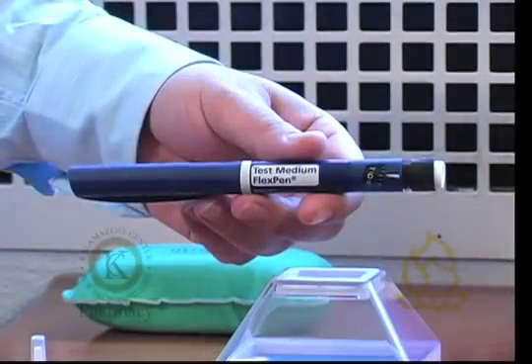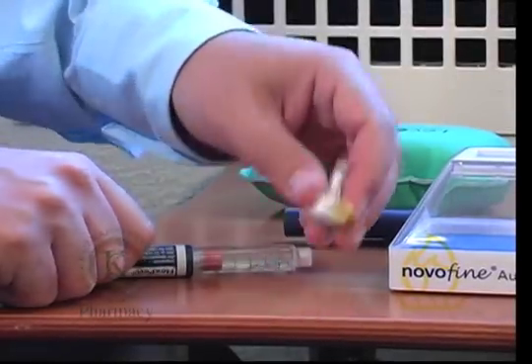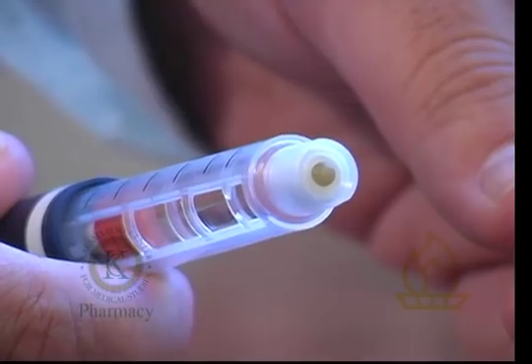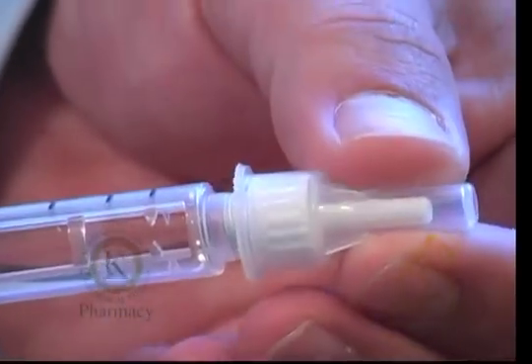This is a demonstration of the insulin flex pen. Remove the cap from the flex pen. Next, peel the seal from the needle attachment. Then screw the needle onto the front of the device by twisting it clockwise.